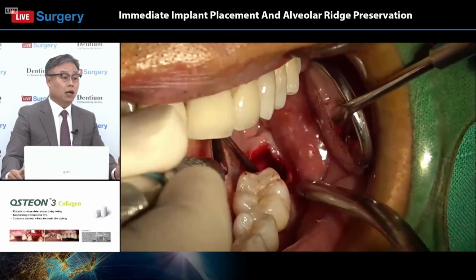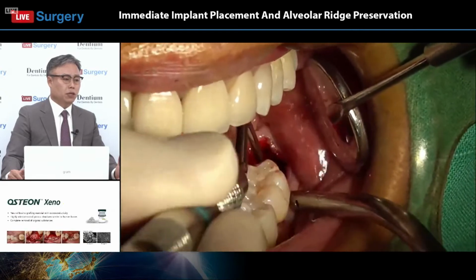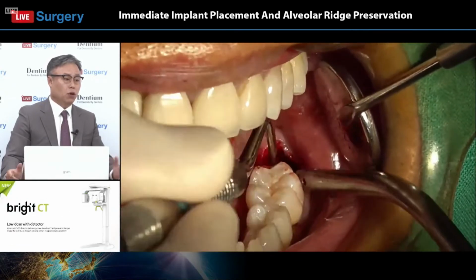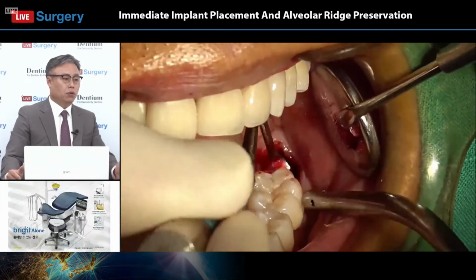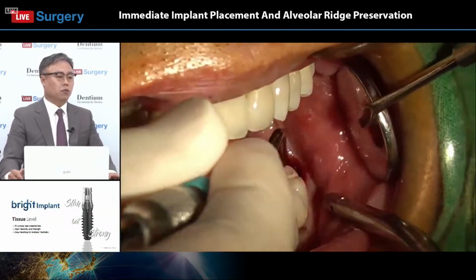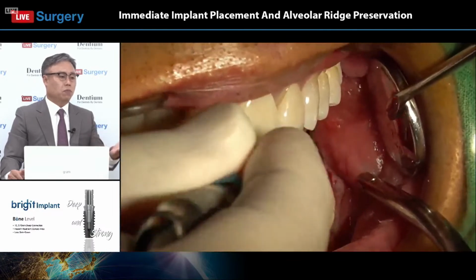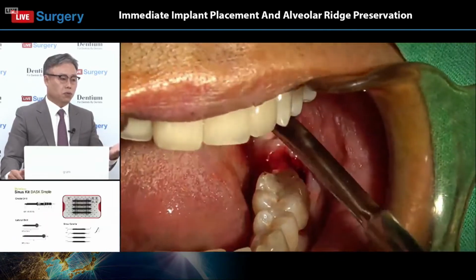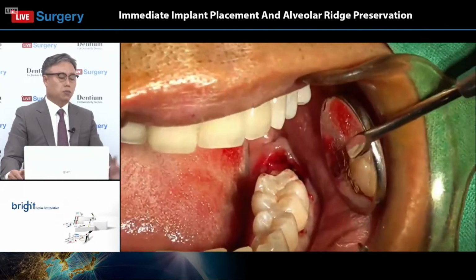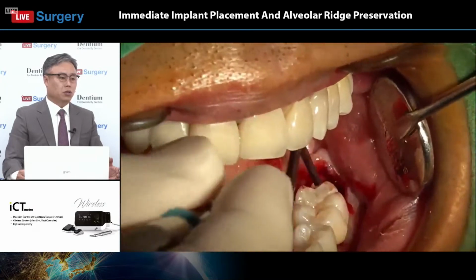It takes a lot of time. After extracting the tooth, which took him about 1 or 2 minutes, see how many minutes he's spending on the removal of the granulation tissue. I think he's doing it because it's a really important procedure for a successful treatment outcome, especially in cases with a lot of inflammation.